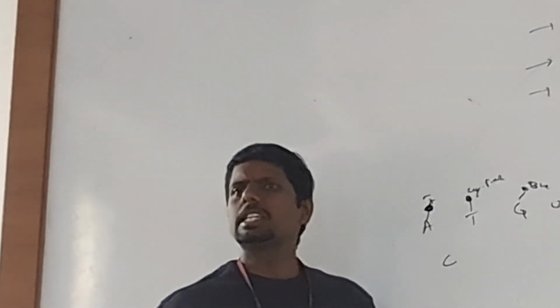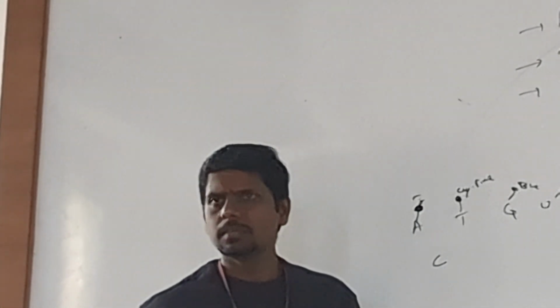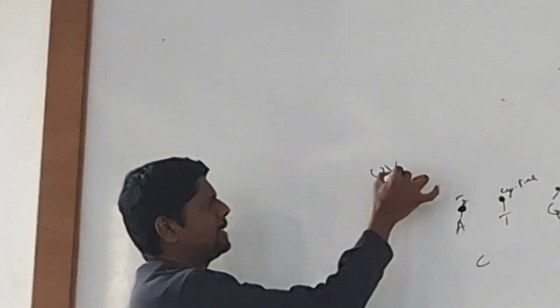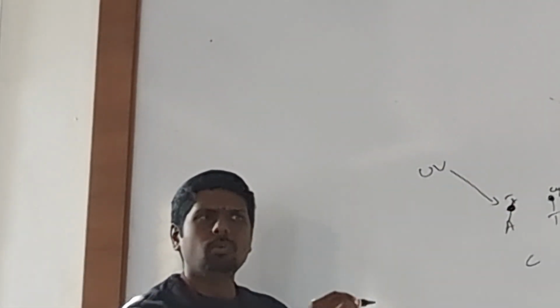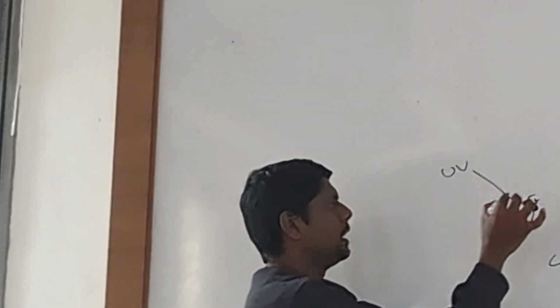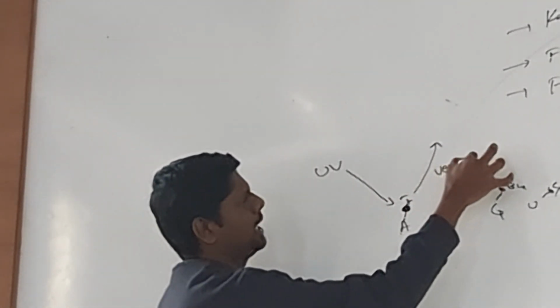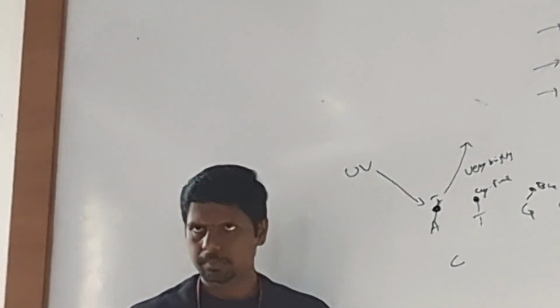What is the significance of the fluorophore? Under UV light, if we hit a UV light on a fluorophore molecule, it will glow very brightly. Very brightly it will glow under the microscope.